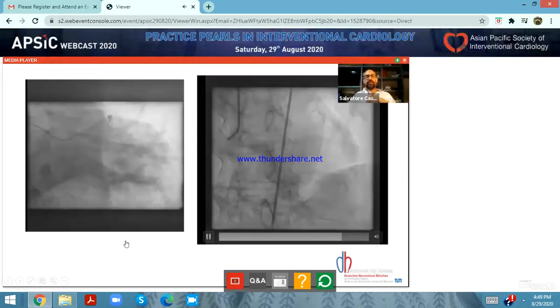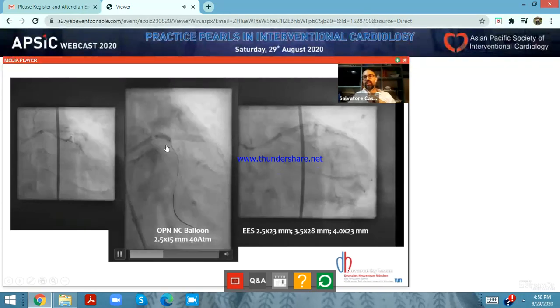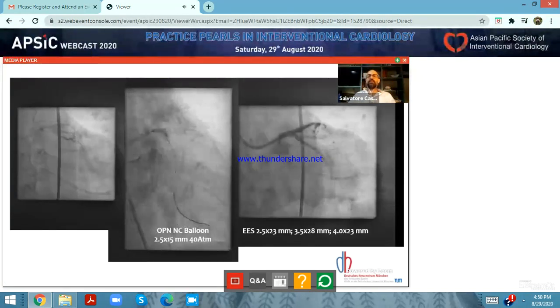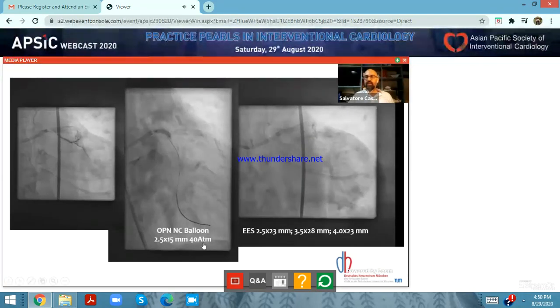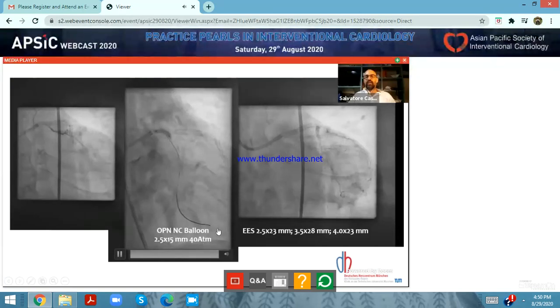So what we did, we performed the recanalization of the LCX, and then we faced the very, very huge calcified disease of the distal left main with a super high pressure balloon, using two guide wires in order to have plaque modification with scoring. There is no scoring balloon on the market that can achieve this kind of pressure. You put a wire between the balloon and the vessel wall, and you can have a super high pressure scoring that is not comparable with any other balloon.